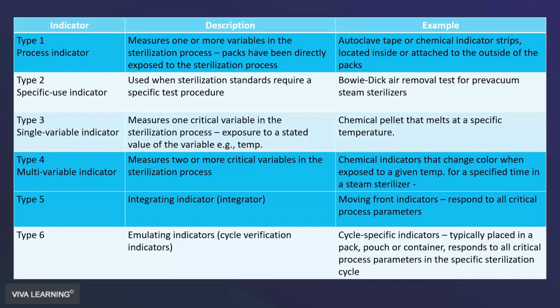It moves along sort of a tube or a space inside that indicator to the pass section. And if there isn't enough pressure and the chemical that's inside hasn't melted appropriately, it can't get through the barrier from the fail side to the pass side. Hopefully that makes some sense. I'll show you some examples in a minute.